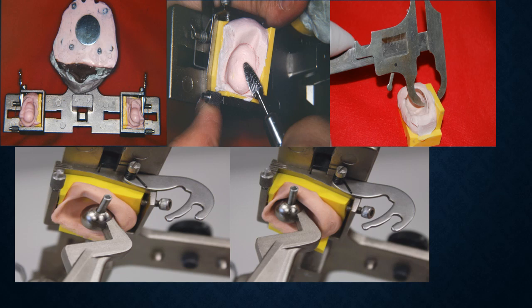As I say, this is just for your knowledge to understand what's meant by a stereographic tracing and a mold made of silicone, a custom made condylar inclination made from silicone putty.